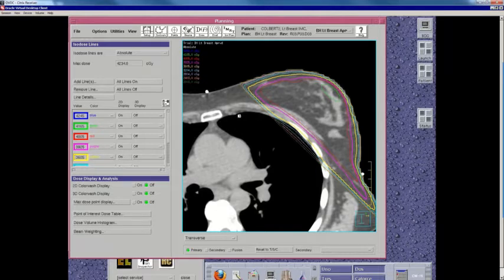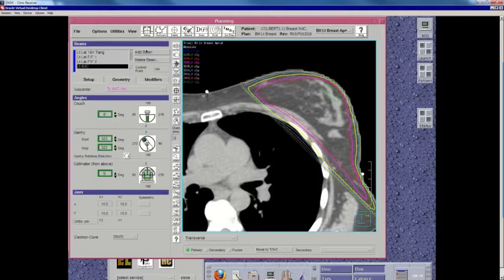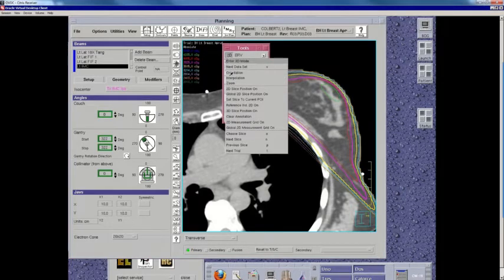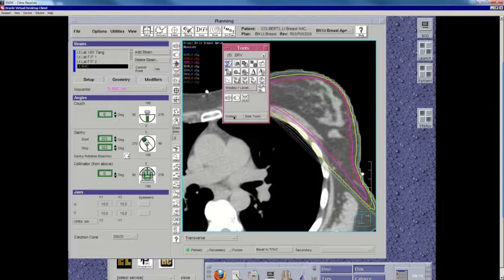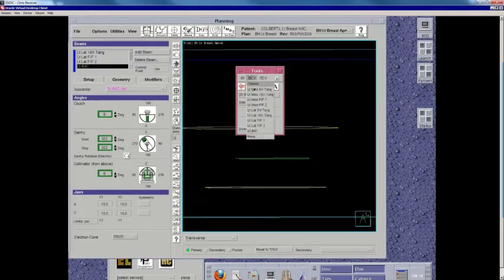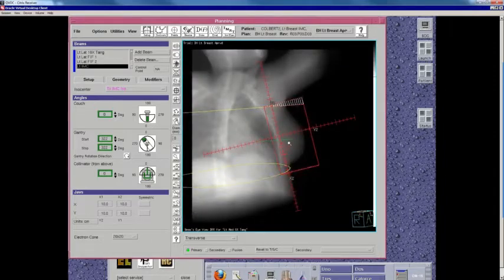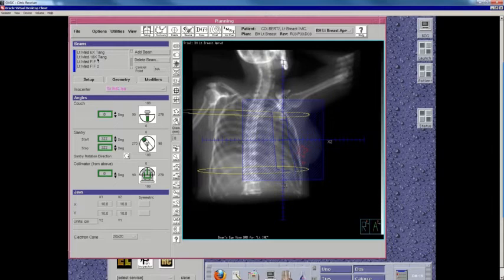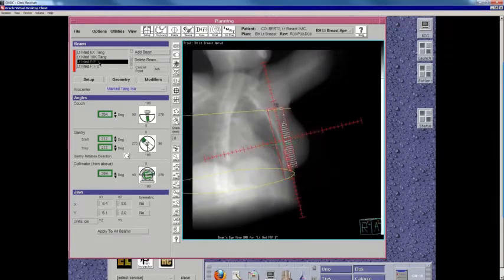And we have a lot of patients who are very thick, as we would say in Texas. So this is a very nice tangent field. We've accomplished this using field-in-field dosimetry. So let's see. I'm going to show you the subfield. So we have a 16x photon field. And actually, I should get it this way. So we have an 18x photon field here. This is one of our field-in-field.